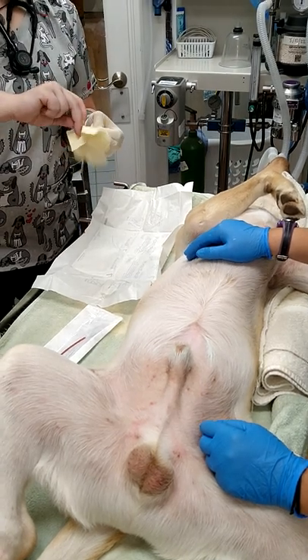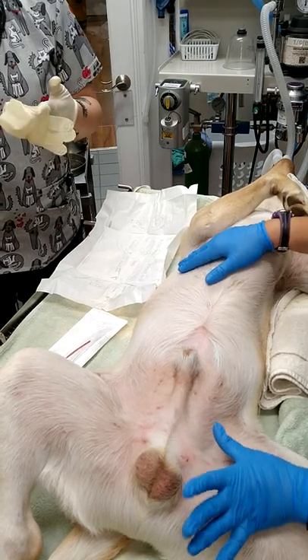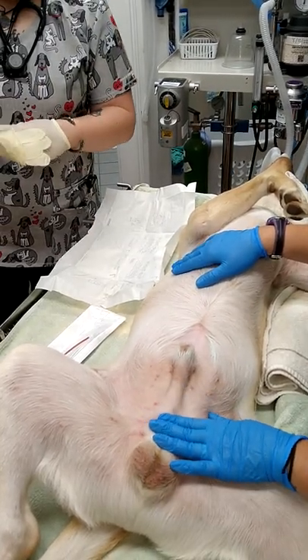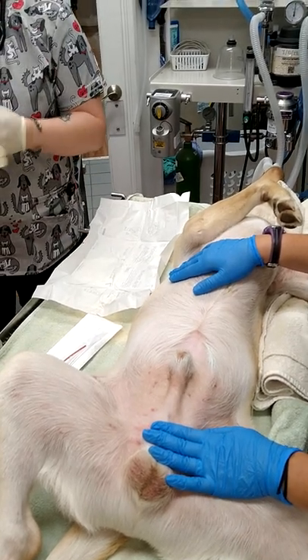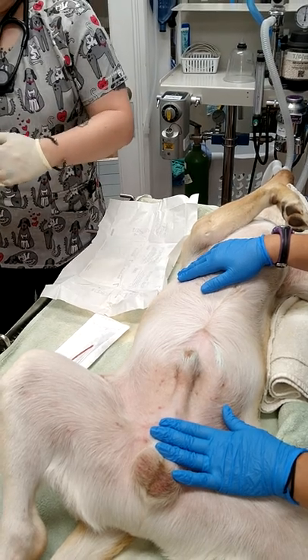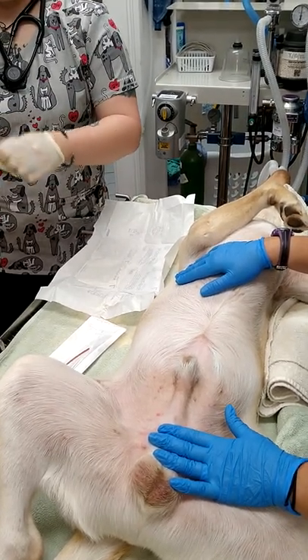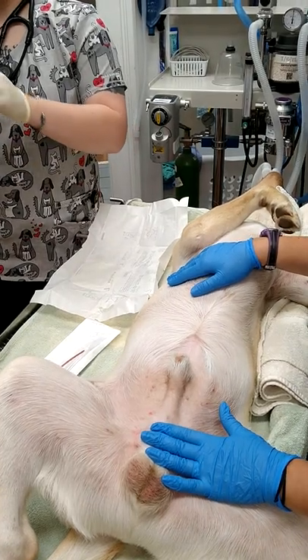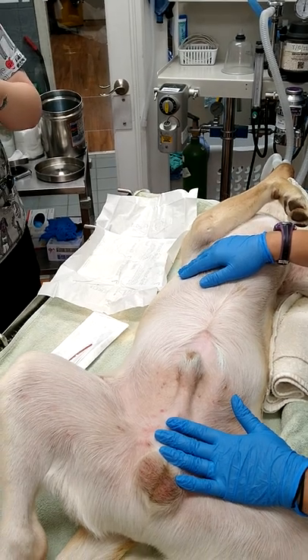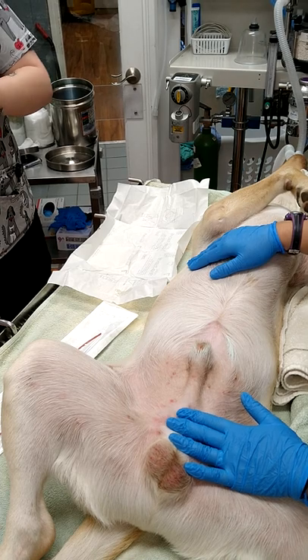I feel like it seemed easier to put in on a surgery. Well, depending on how humid the environment is will really change your skin condition too, because depending on if I'm out here and they're putting on sterile gloves, there seems to be a difference.